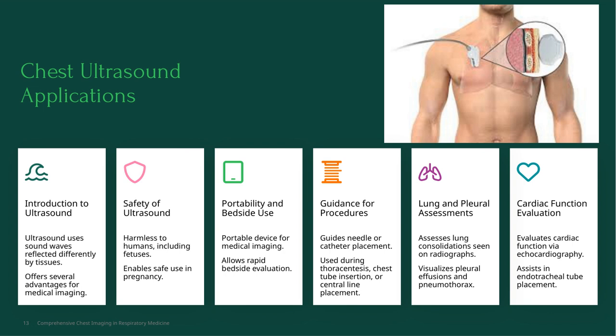These devices are small and portable, meaning we can bring them right to the bedside for quick assessments, which is essential in urgent situations. And we must emphasize that ultrasound is completely safe. It's harmless to humans, including fetuses, making it a reliable tool even in pregnancy.